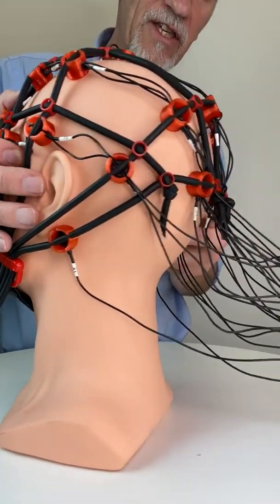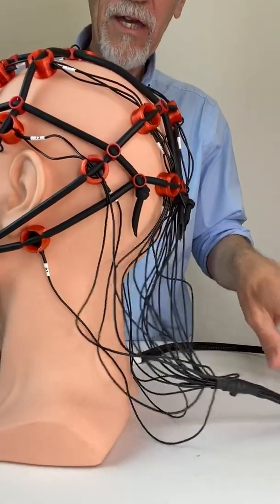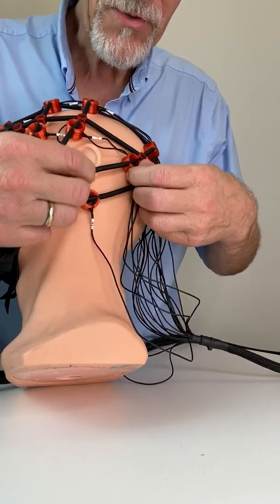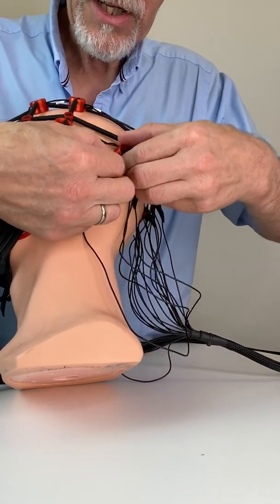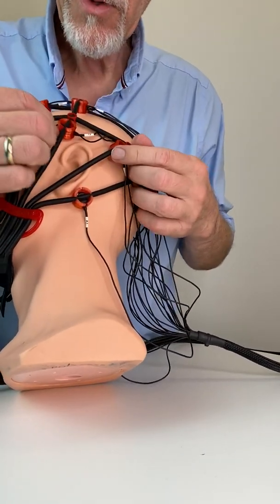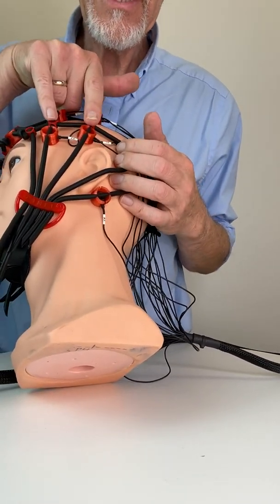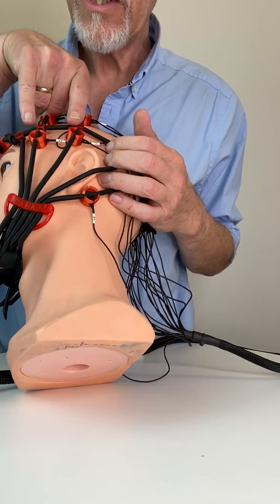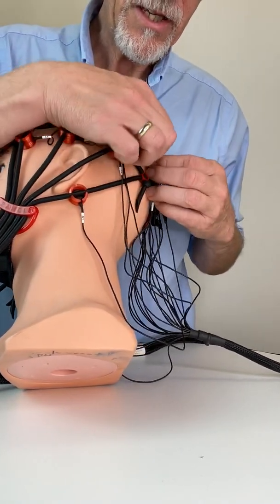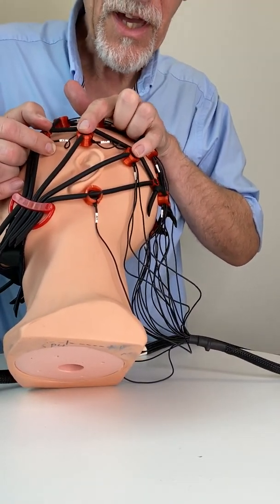Look at T5 and T6. Look at the line of T3 and T5 — we have a little bit of a loose string here but not so much. I try to correct it. I make sure that the distance between T3 and F7, for example, is about four fingers. It should be a little more, so I correct it and put this a little bit more here. I can also correct the distance between T3 and T5. That's okay.